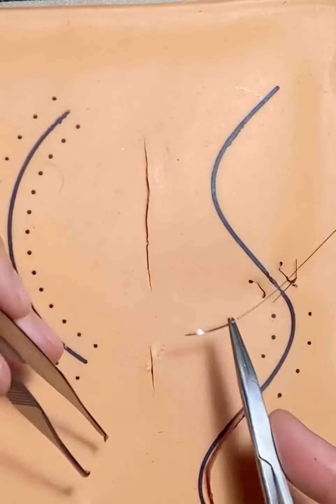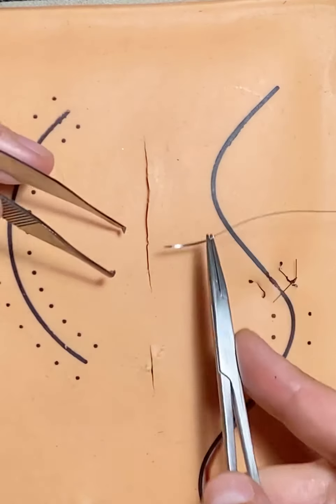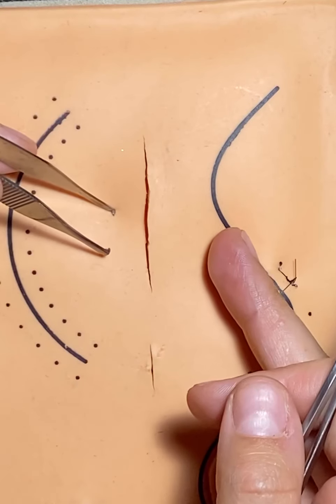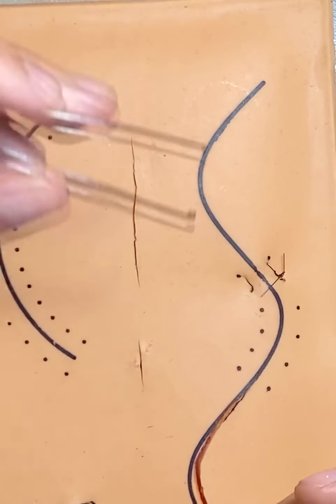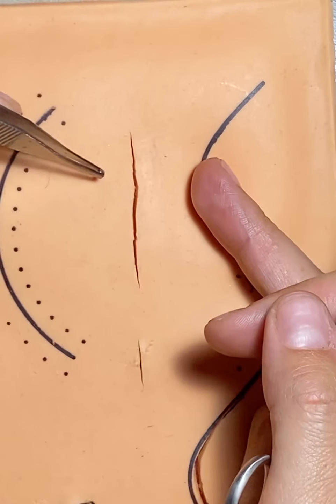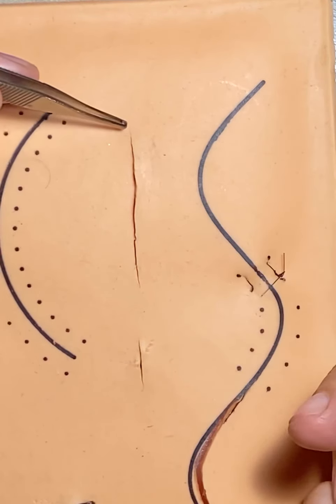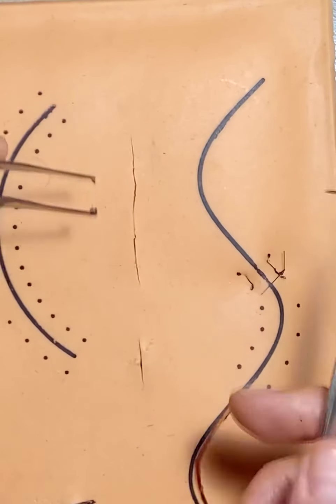You can do this over simple interrupted stitches, or you can use this if you have a long incision and you're trying to save time. It also helps in some indications to decrease tension over the wound because it's spread out along one big stitch.